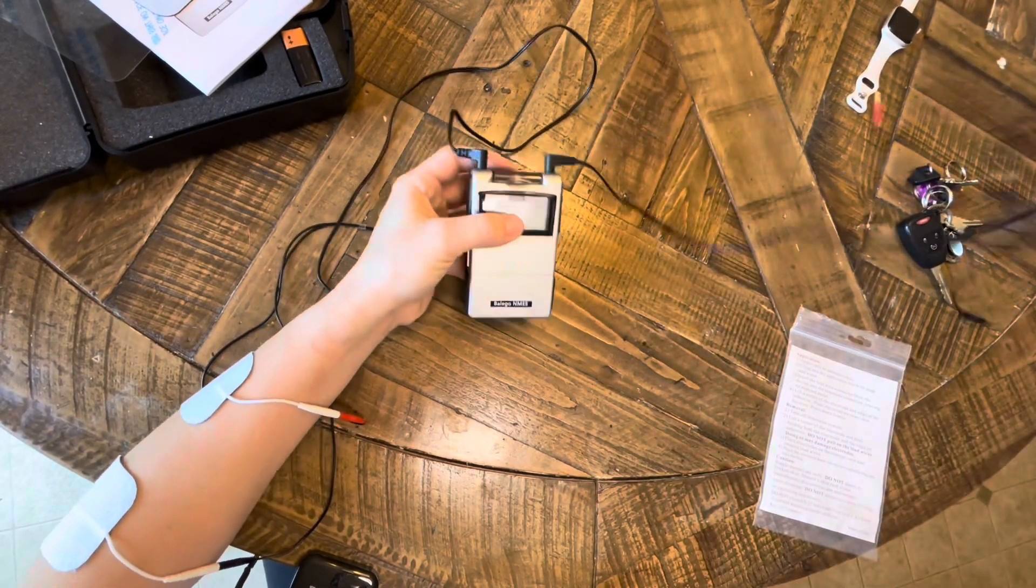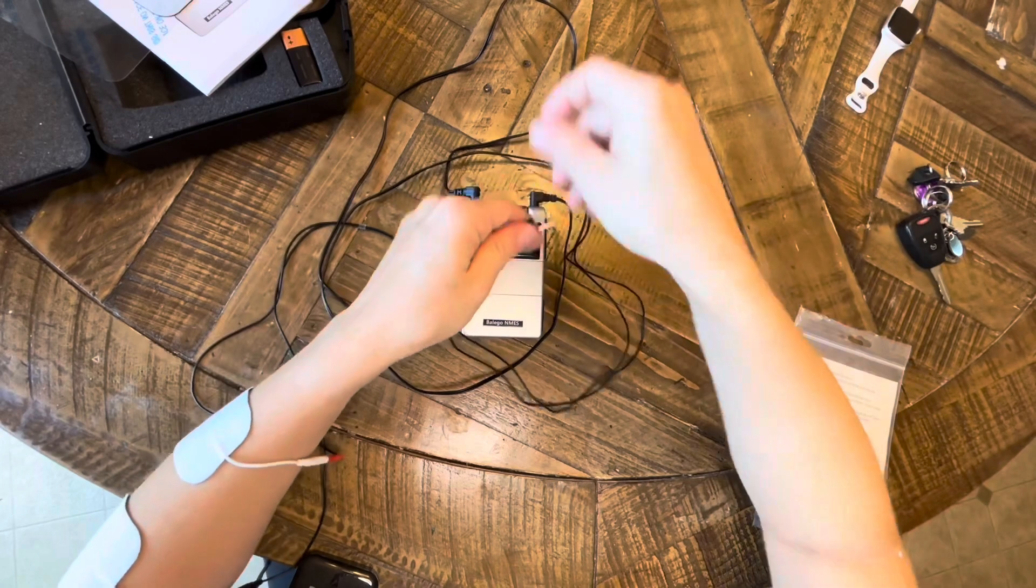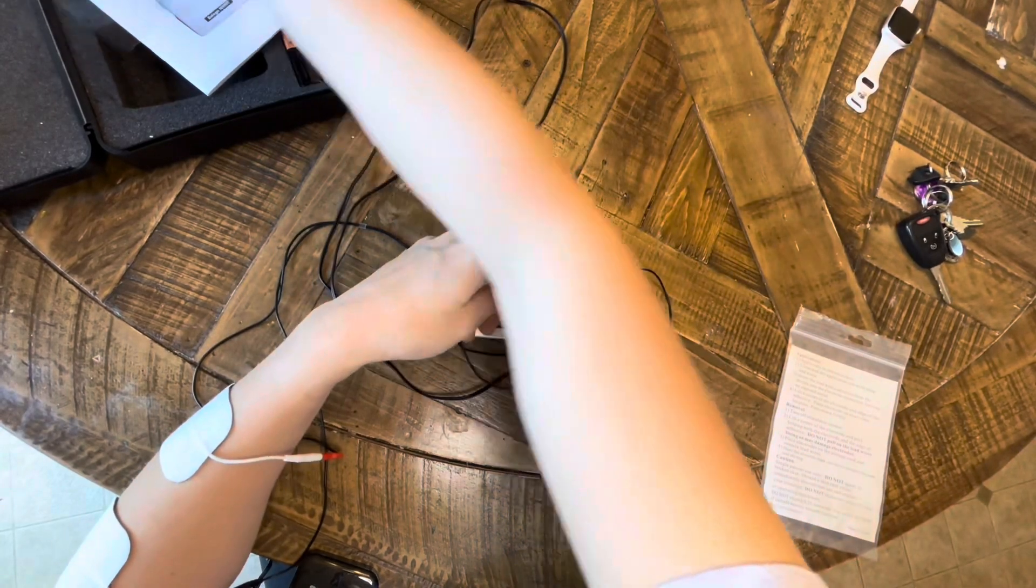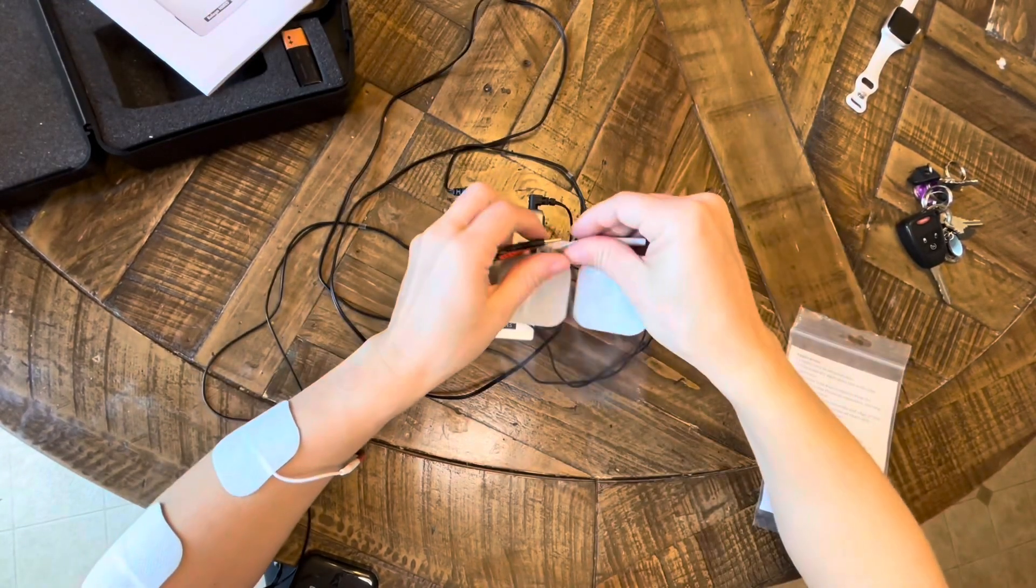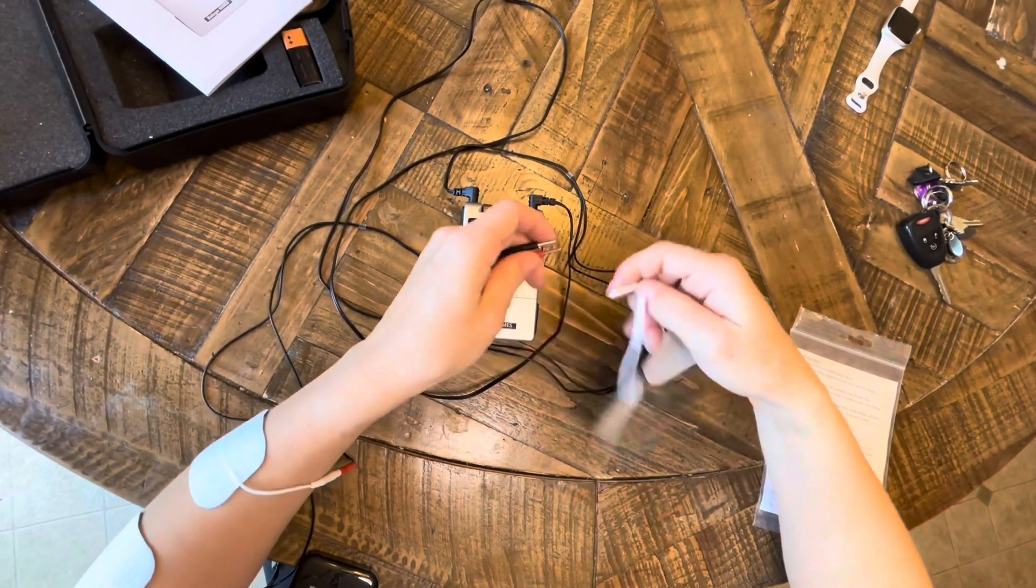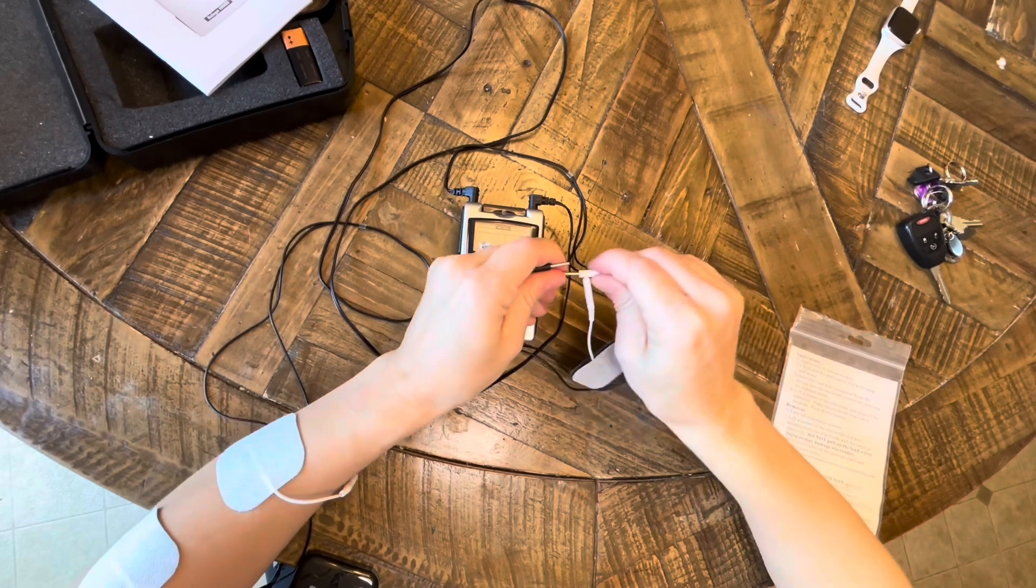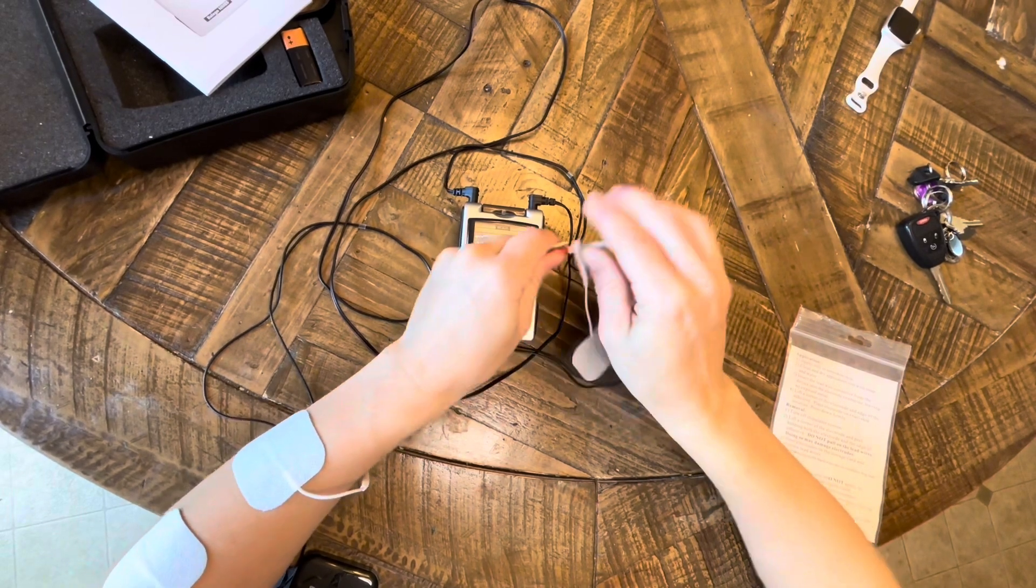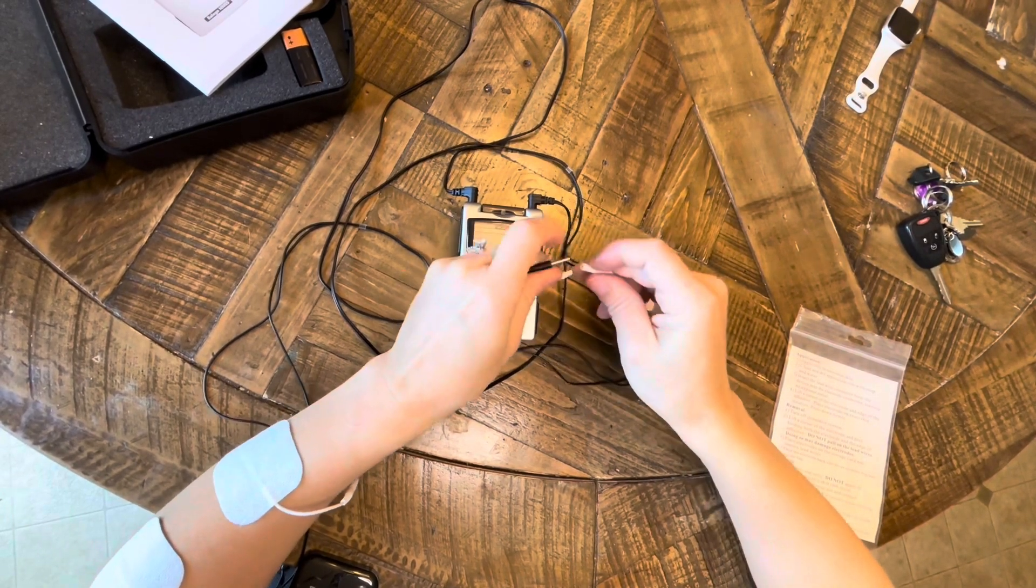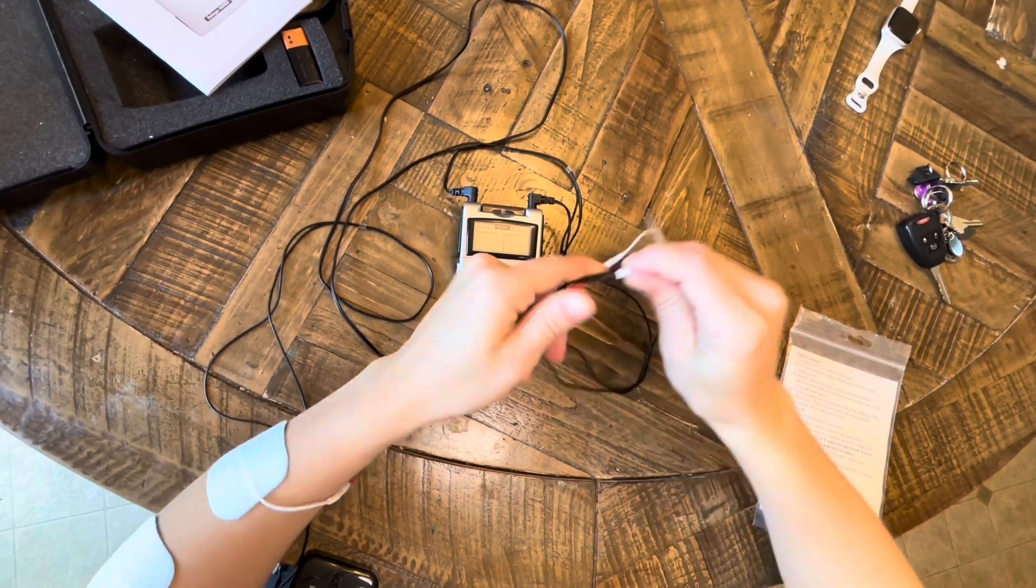So now I'm going to add channel 2, and we're going to work not just those extensors to open up the hand, but also our flexors to work on finger flexion or actual grasping.